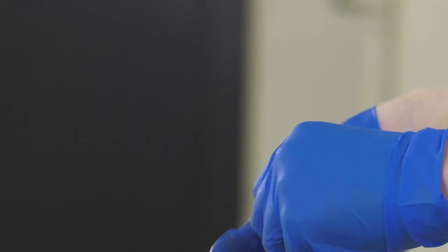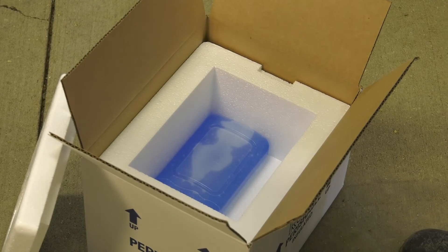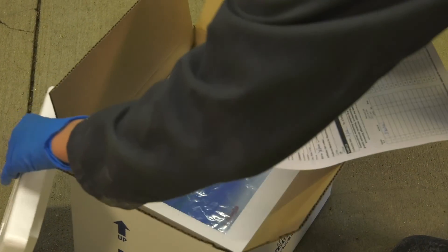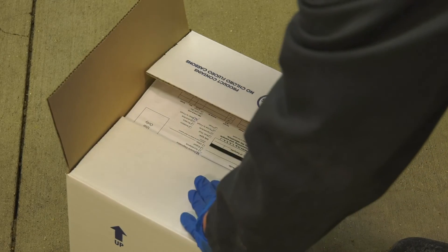Anything that could possibly contaminate the sampling from one pig to the next must be replaced or cleaned. Once you are finished collecting all your samples, secure the tubes in the cooler with enough ice packs to maintain a temperature between 32 and 40 degrees Fahrenheit or zero and four degrees Celsius. Secure the lid on the cooler with packing tape. Include a completed submission form and the appropriate mailing information.